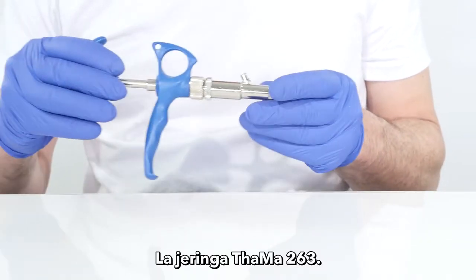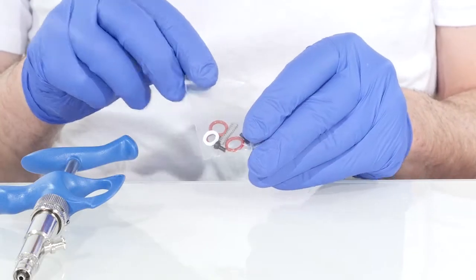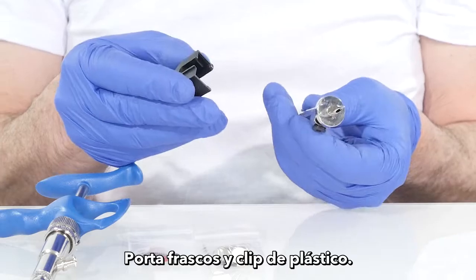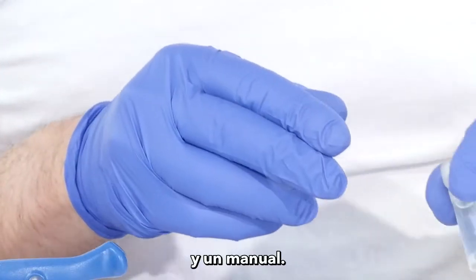What's inside the box? The TAMA 263 automatic syringe box contains the following: the TAMA 263 syringe, spare parts kit, piston set, vial holder, plastic clip, castor oil, and a manual.